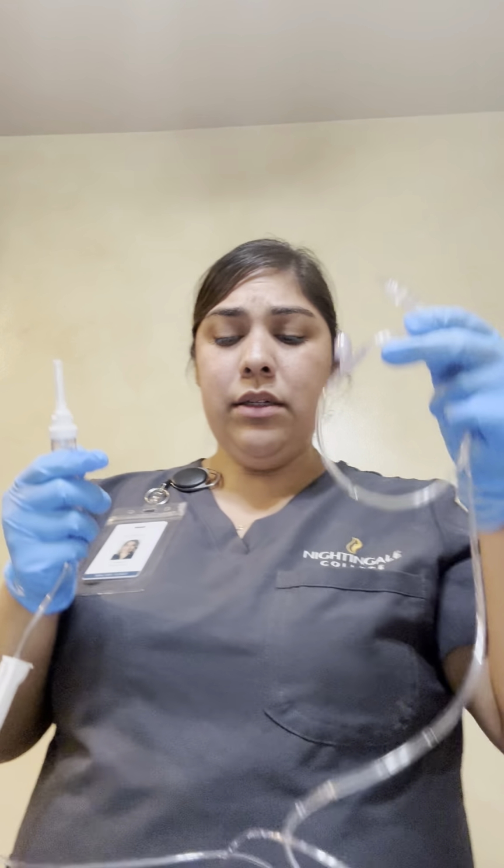Before we even begin, of course, we verified patient privacy, hand hygiene, and identified the patient with at least 2 identifiers. Again, we will go over the 6 rights of medication administration. They verified they're not allergic to any medication, especially amoxicillin. So we're going to go ahead and start this demonstration.